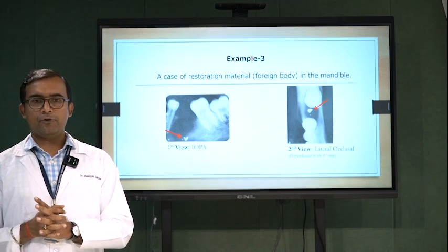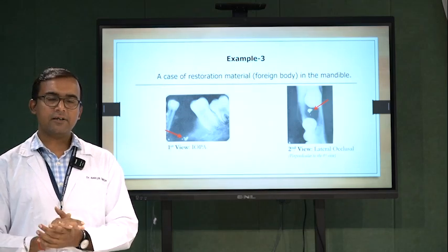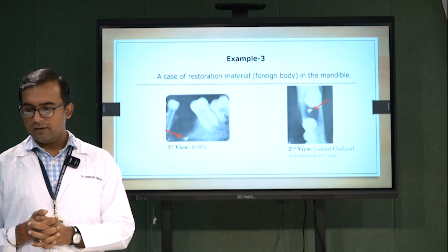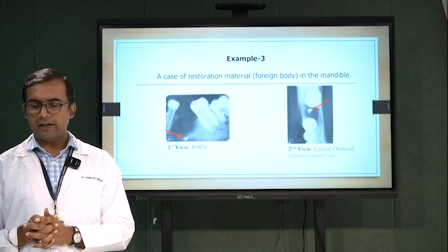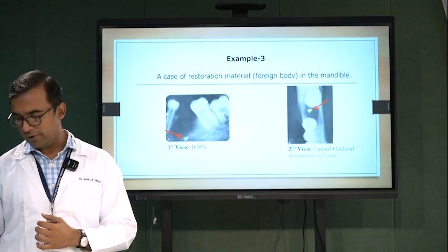So we need not worry about the cortices, although it is close to the buccal cortex but not the lingual one. But it is appreciated that it is present periapical to the 4/6 and quite below it only.